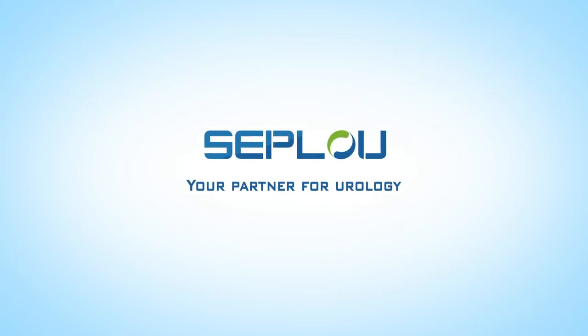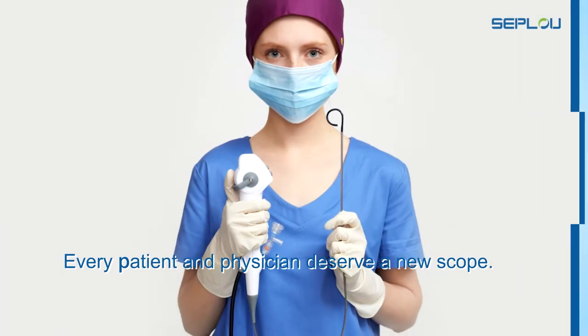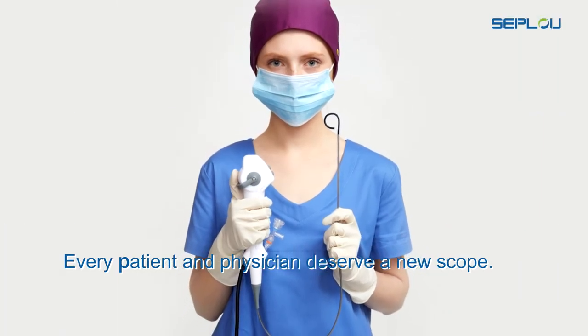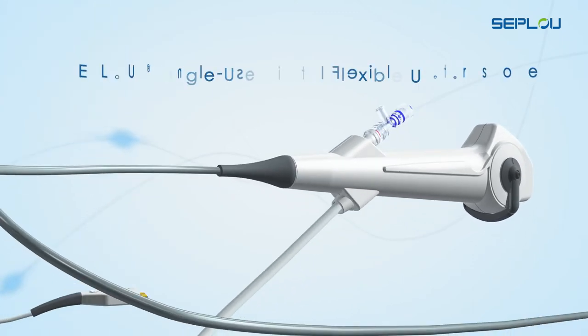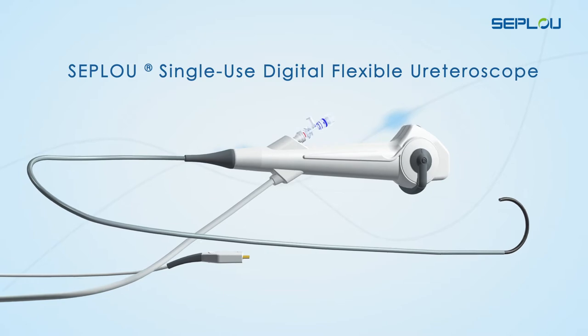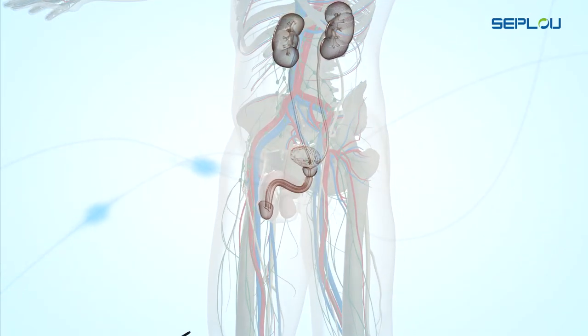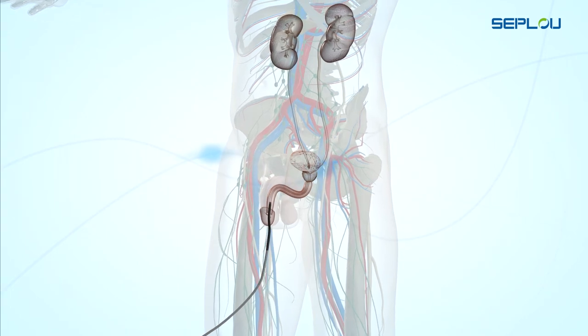Seplu, your partner for urology. Every patient and physician deserve a new scope. The Seplu Single-Use Digital Flexible Ureteroscope is intended to be used by physicians to access, visualize, and perform procedures in the urinary tract and the kidney.